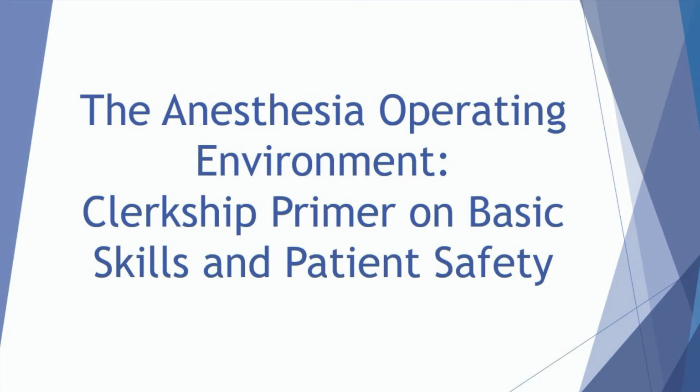I'm one of the Georgetown anesthesia residents, and this video is meant to serve as a primer for third and fourth year medical students prior to your anesthesia rotation to show you some of the skills and techniques we employ every day in the operating room and to jumpstart your experience and to get you involved starting on day one.